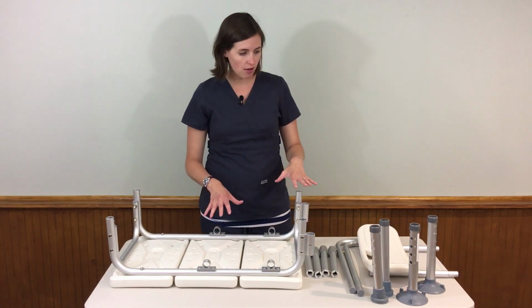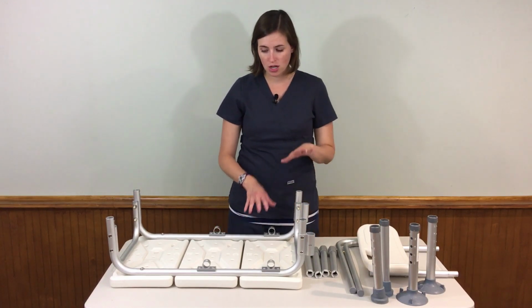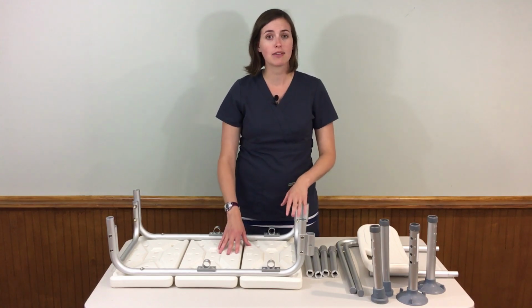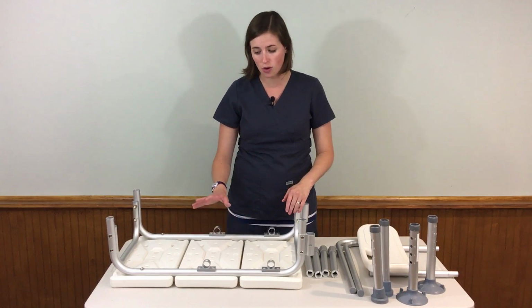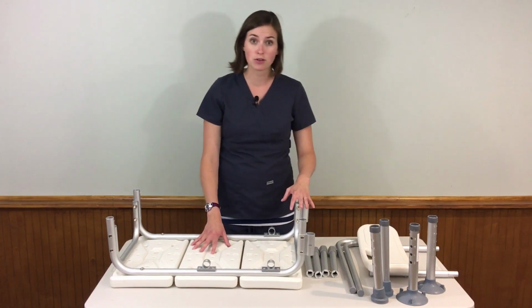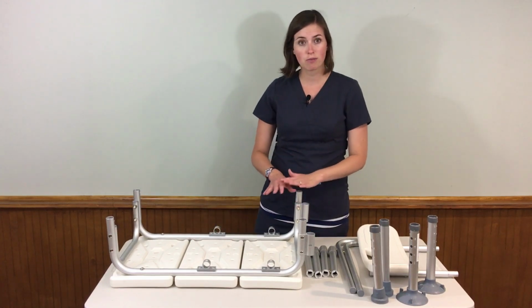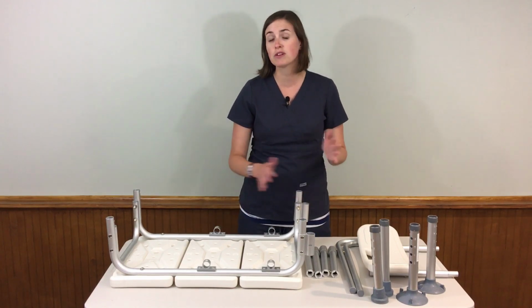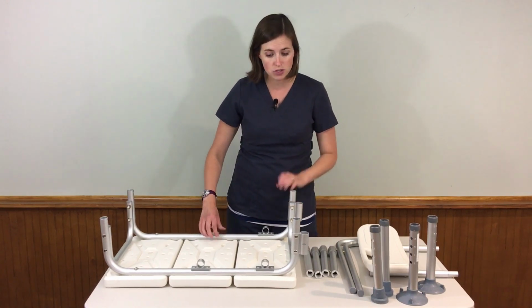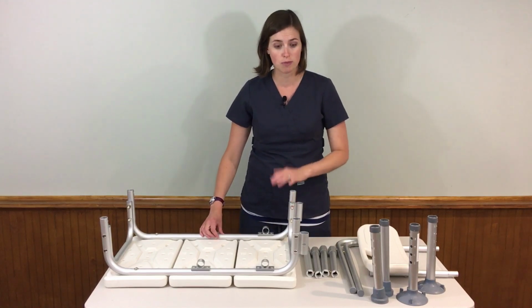So today we have a standard tub transfer bench, solid plastic body. They do come in the padded form, but most of them are assembled in roughly the same manner. So this is a pretty typical model. So we'll start here. First thing you want to make sure is you have all of the parts. If you're buying them used or even if you get them new, sometimes they may be missing, so you want to check that out before you get them assembled.